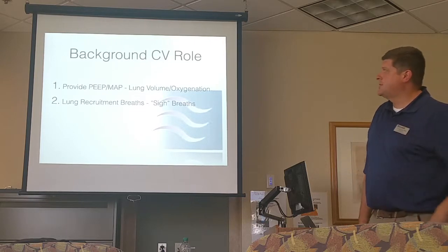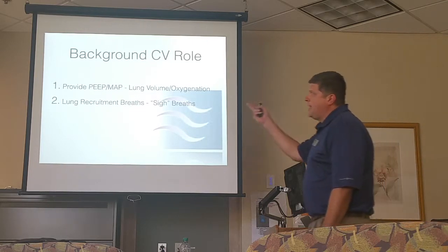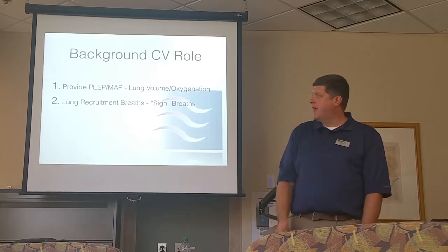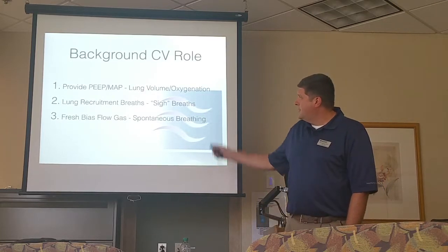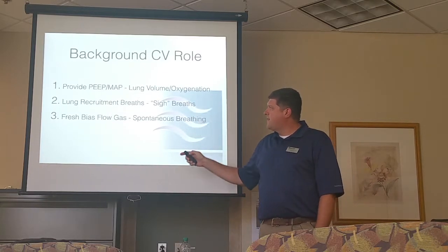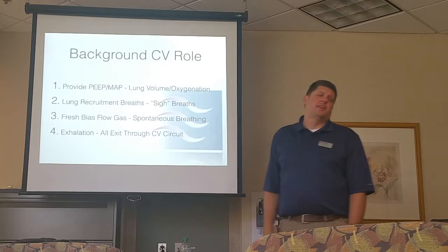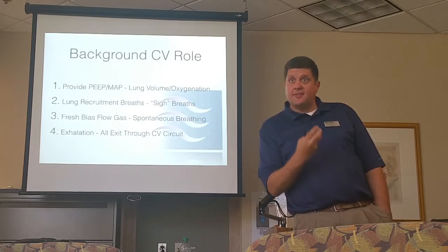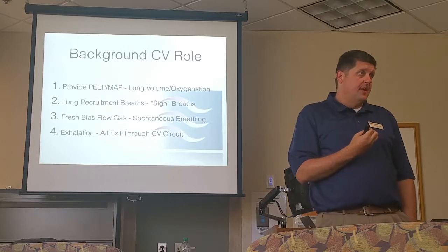So the role of the conventional ventilator is to provide that PEEP and mean airway pressure. That's really the bigger picture that we're after. Then there's the lung recruitment, the sigh breaths, which we'll chat about in just a second, but here's another very important thing that the conventional ventilator does. It provides the biased gas flow for the baby to breathe spontaneously. It gives him that fresh gas support that he needs.